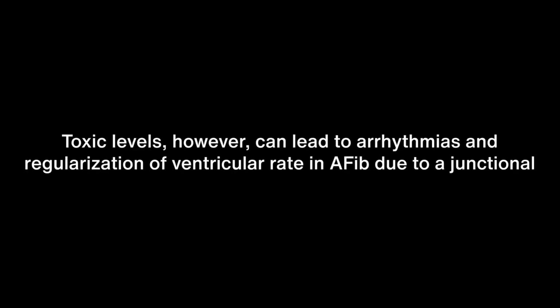For instance, therapeutic levels of digitalis can cause ST downsloping, T wave depression, QT shortening, and slowing of the ventricular rate in AFib. Toxic levels, however, can lead to arrhythmias and regularization of ventricular rate in AFib due to a junctional rhythm and AV dissociation.